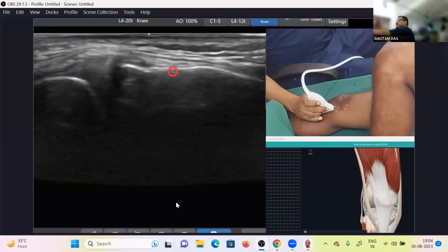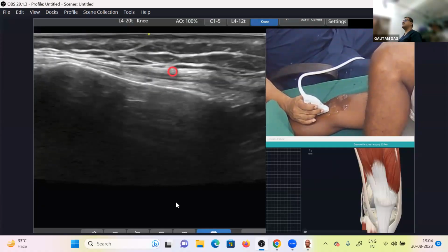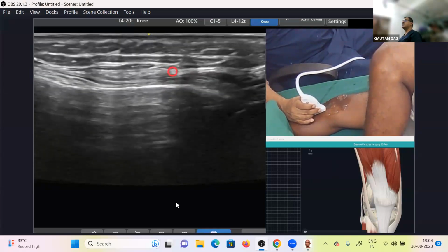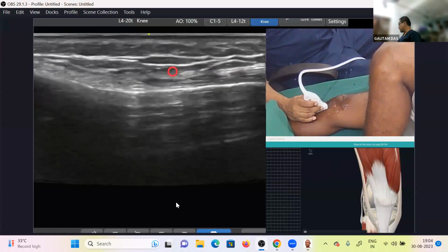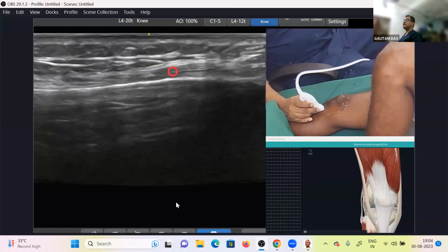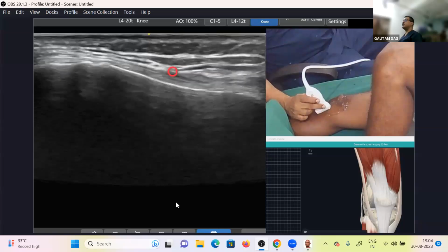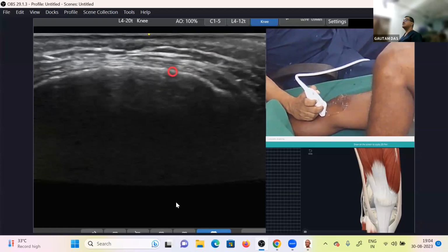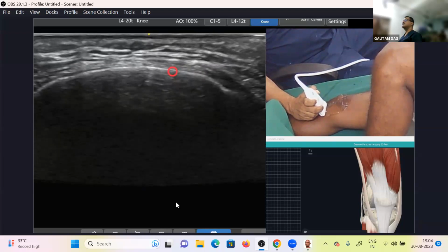Okay. So again, let me come here. I was here. Superficial layer of the medial collateral ligament, and it is coming there, and we can see the pes anserine tendon there. So this is the medial part. At the same time, the inferior medial genicular artery I have shown you, pulsating nicely. And normally the injection should be done in the long axis of the artery in this view.